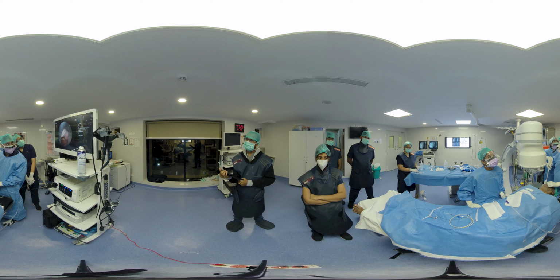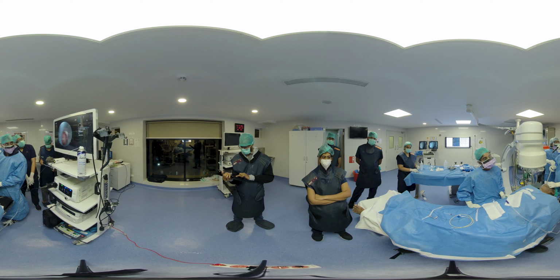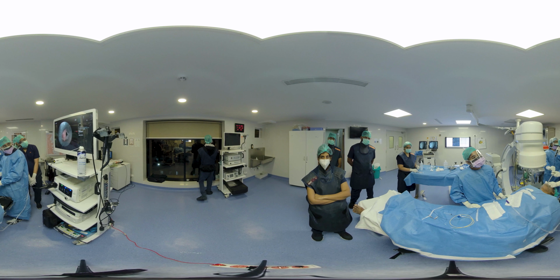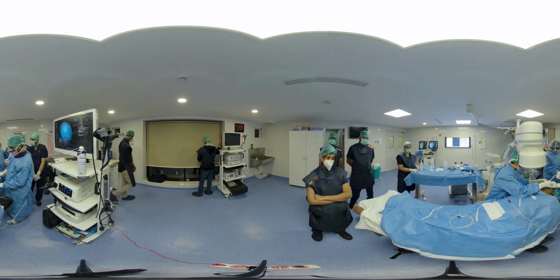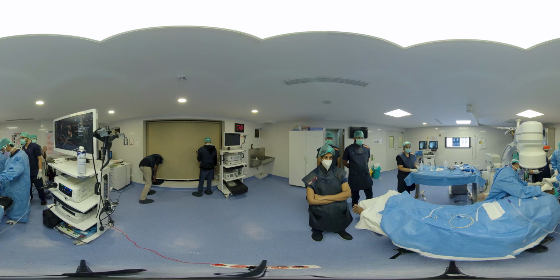Now you will be able to see the first anatomical landmark, which is the uvula. Now you can see I am putting pressure on my thumb, which acts like a fulcrum, and now I am able to see the epiglottis here. Once you see the epiglottis, go below the epiglottis, you will be able to see the glottis, and once I see the glottis, I rotate my scope, making sure that I don't injure the vocal cords, and through a corkscrew motion, I am inside the trachea. Now I am holding and securing the rigid in place, and meanwhile we are connecting to the ventilator.